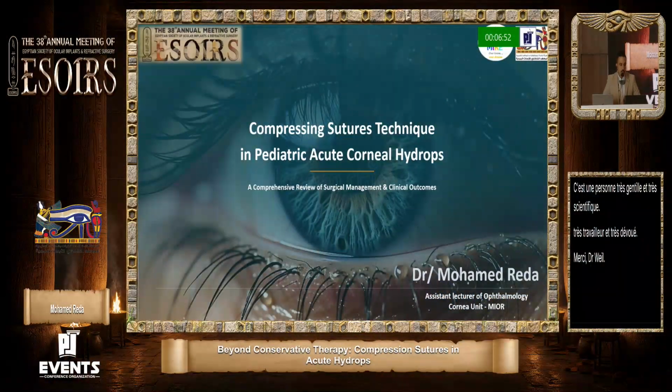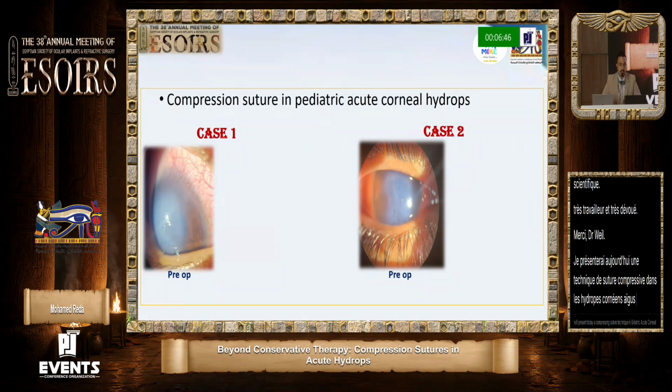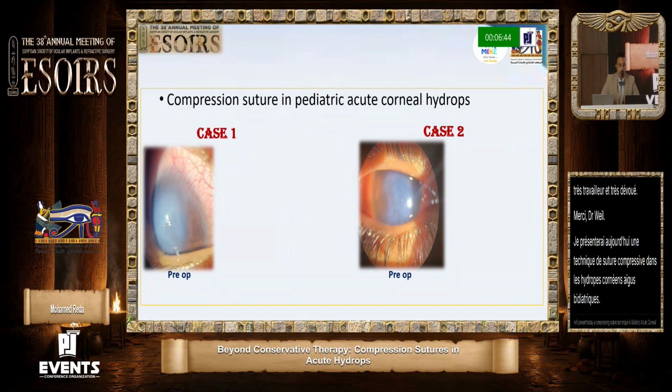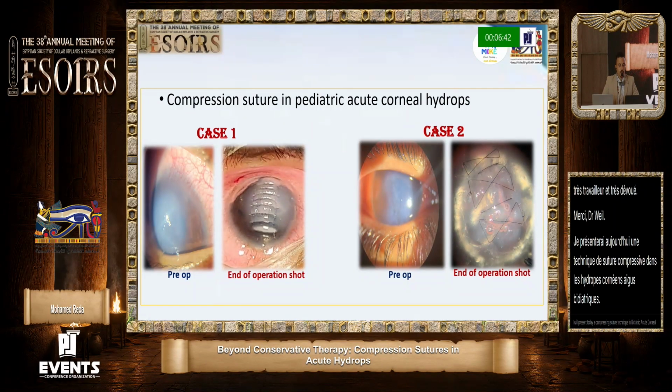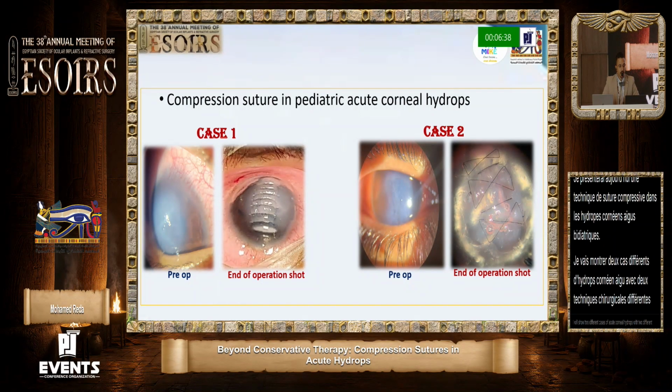We'll present today compressing suture technique in pediatric acute corneal hydrops. I will show two different cases of acute corneal hydrops with two different techniques of surgical compressing sutures, and what is the difference in techniques about the results.